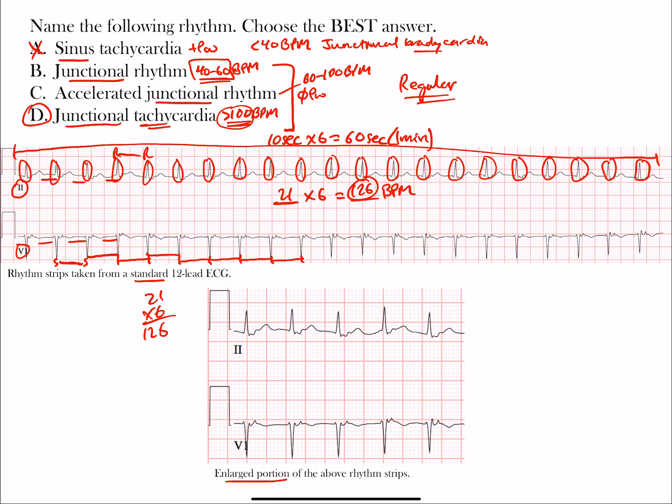We found the rate one way, but because this is a regular rhythm, we can use another method. Find an R wave on a thick line, then find the next R wave. Count the number of big boxes between them - one big box, two big boxes, and another one and a half. Because there's two big boxes, you do 300 divided by 2, which is 150. But it's a little beyond that, between 2 and 3 boxes. 300 over 3 is 100, so it's somewhere between 100 and 150.